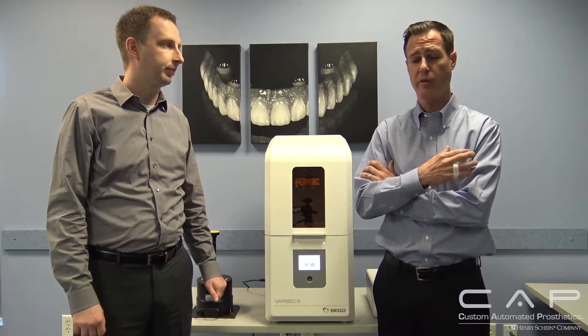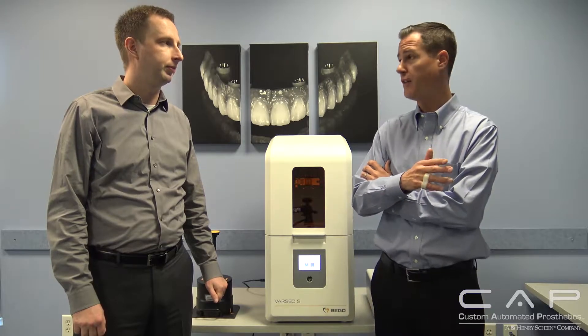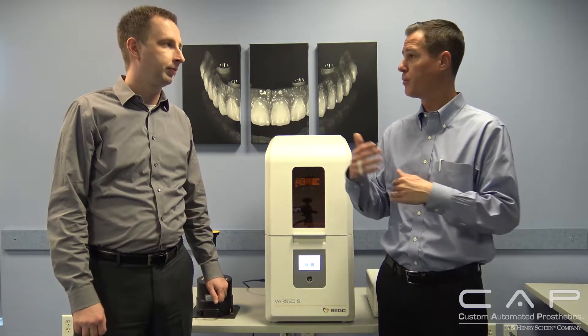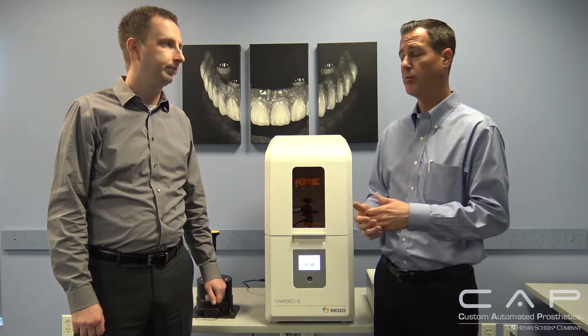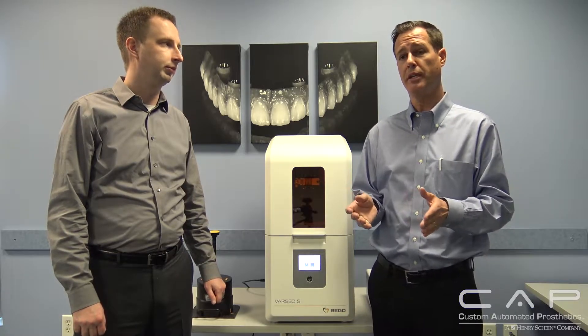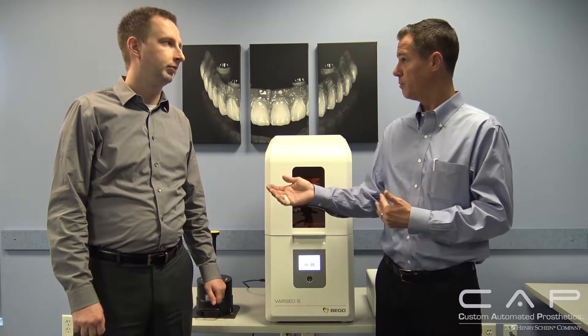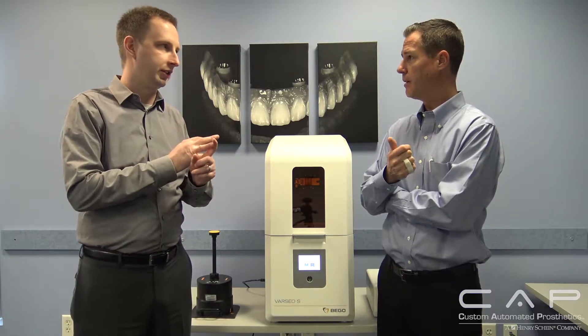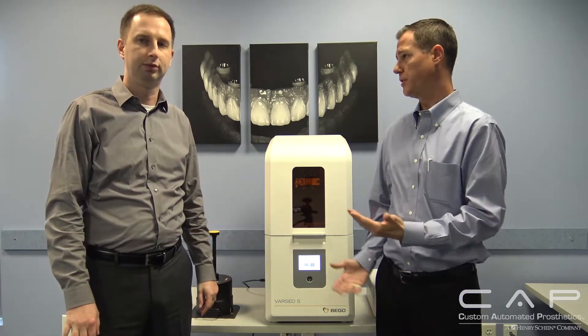We've gone through great pains to validate all of our processes, from start to finish all the way through post-processing. We have a validated process. And Bego being a dental company, we also have every single material — investment, metals, casting machines — everything through post-processing. It makes a lot of sense. We're over a 100-year-old dental company, and this printer was developed specifically for dental labs by a dental company.